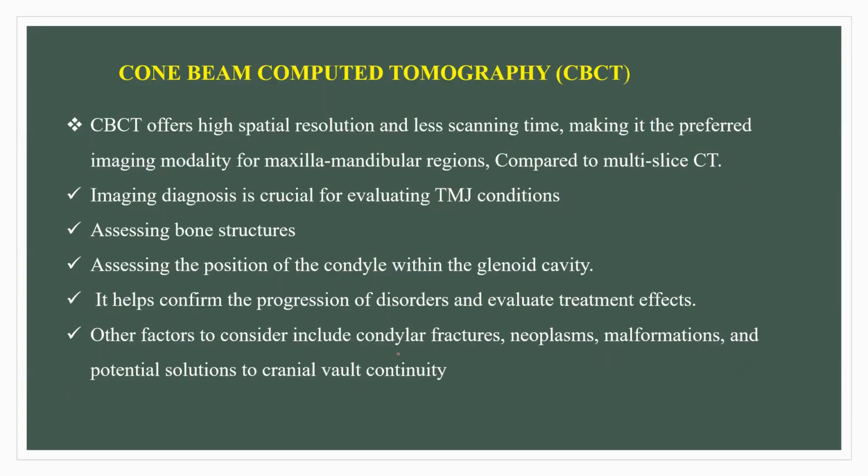Coming to cone-beam computer tomography, it offers a high spatial resolution that is very useful for us. It offers high spatial resolution and less scanning time, making it the preferred imaging modality of the maxillomandibular regions compared to MDCT. Imaging diagnosis is crucial for evaluating TMJ conditions.